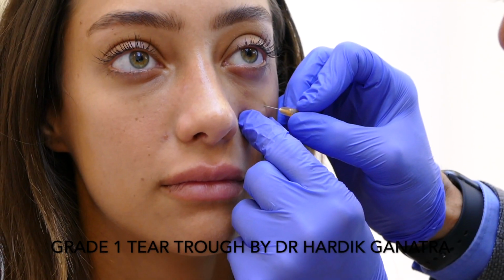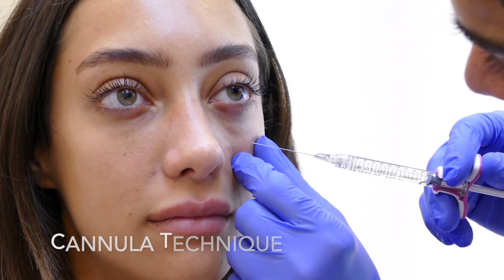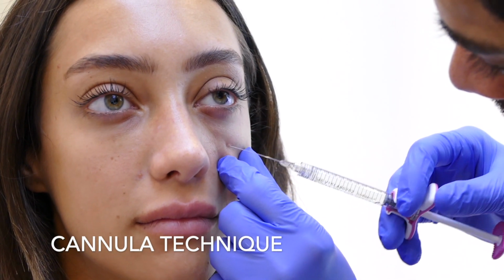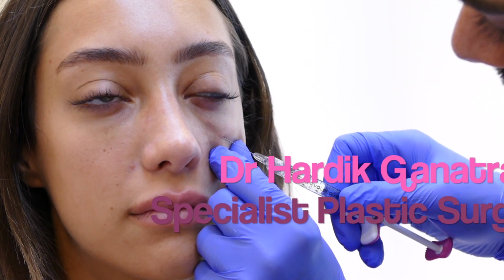This video shows tear trough correction performed by Dr. Hardik Ganatra using a cannula technique. Dr. Hardik Ganatra is a specialist plastic surgeon who's specialized in facial rejuvenation.